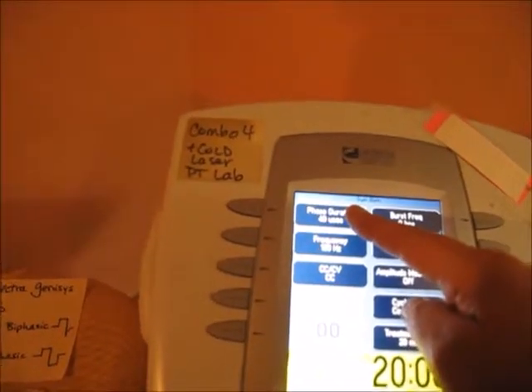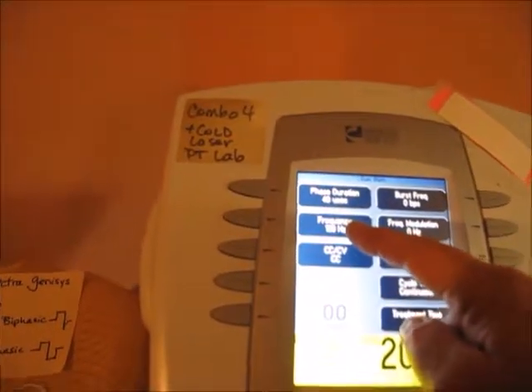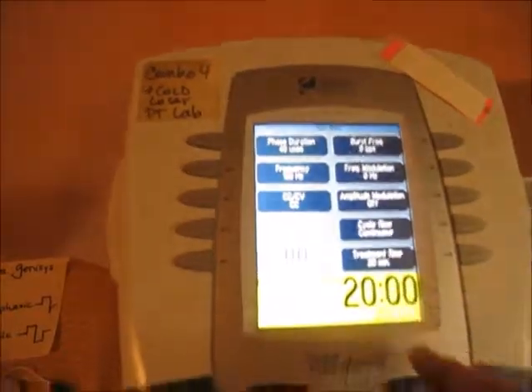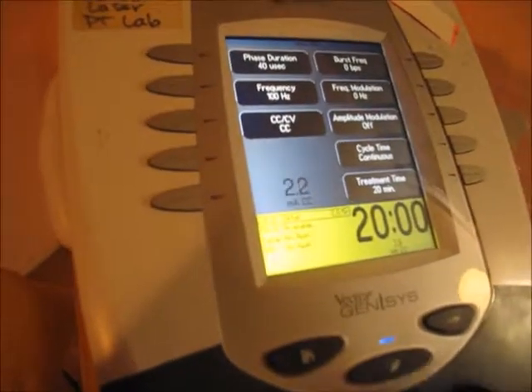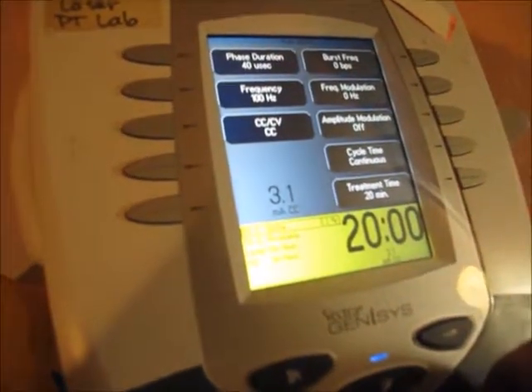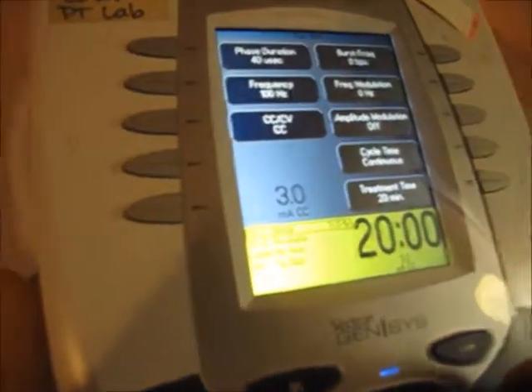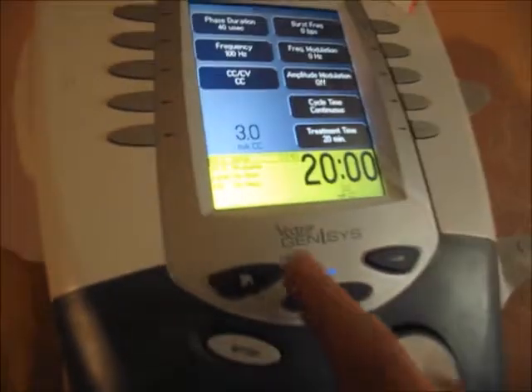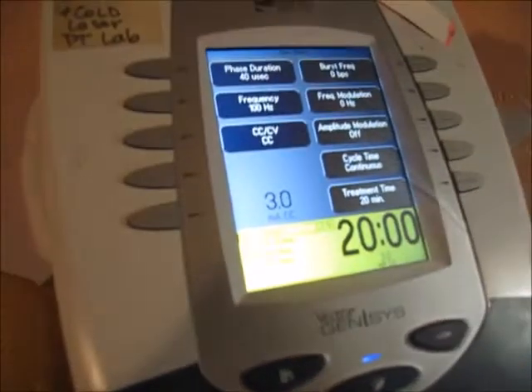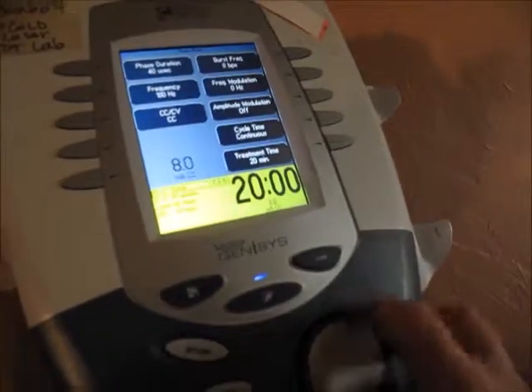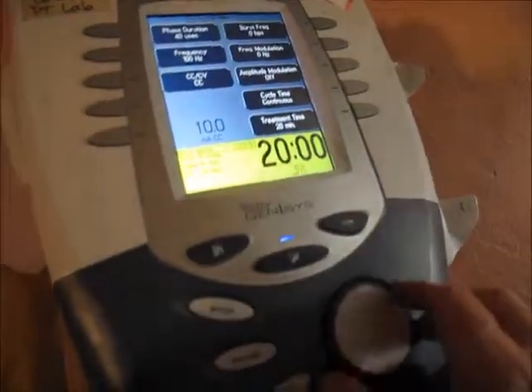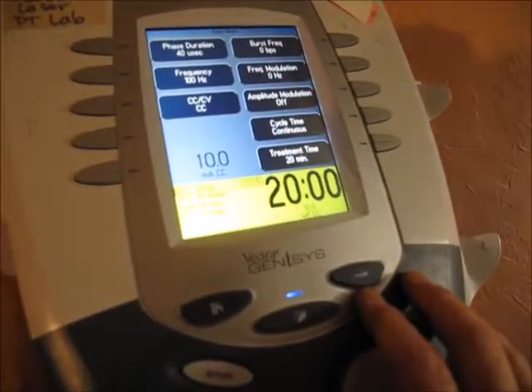You don't need to worry about those modulation settings for this treatment. All you need to set is phase duration to 40 at the beginning, frequency to 100 Hz, and then turn up the milliamps. The amplitude starts at 3 milliamps and you can increase it, but do not go above 30 milliamps.